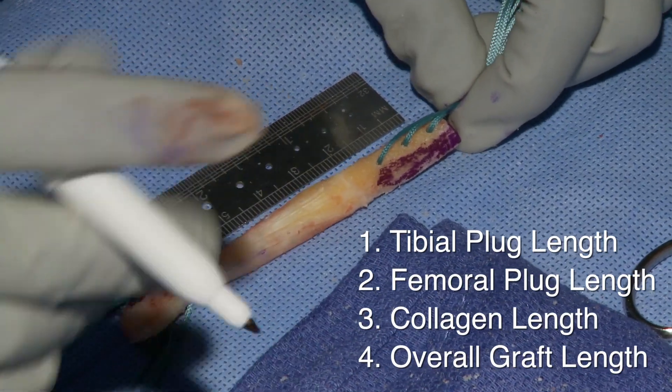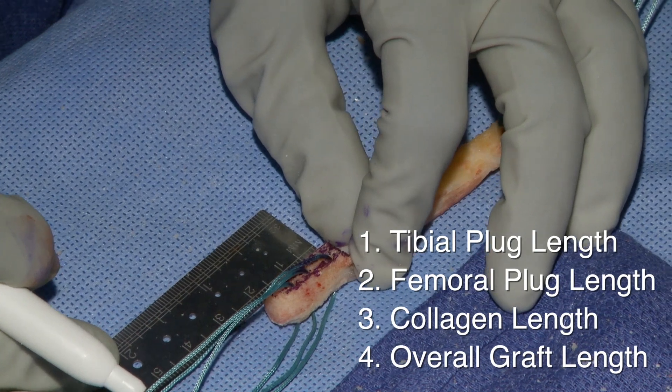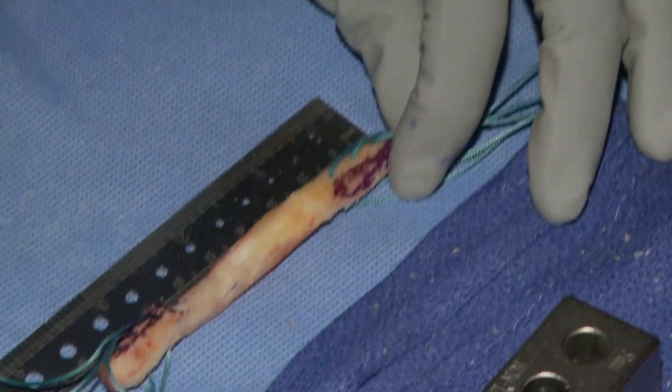The overall length is usually going to be anywhere between 80 to 100mm. If it's short and the patient is rather tall, definitely tell the attending so that they know, because we may have to make adjustments in our tunnel length.